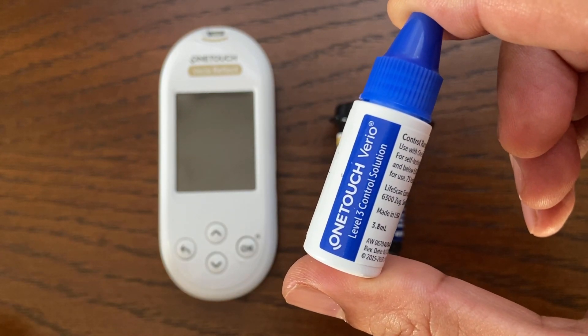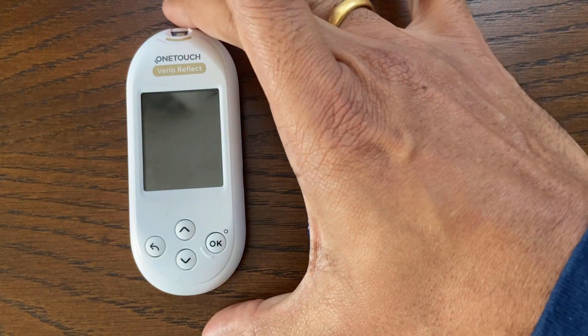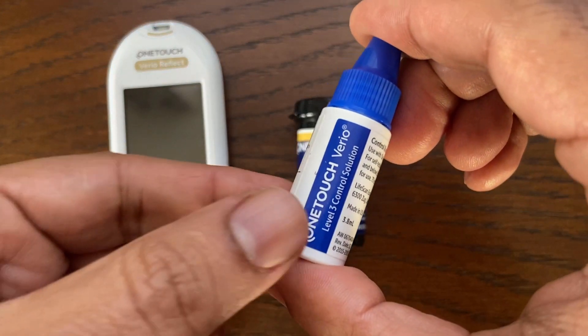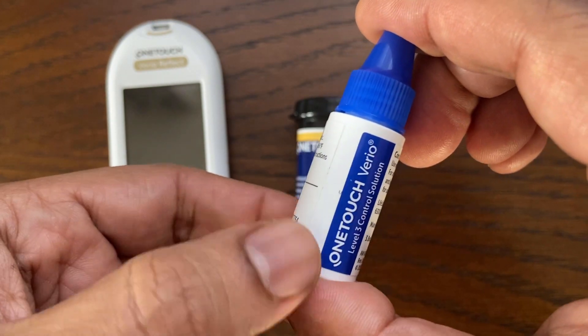This video demonstrates how to check the OneTouch Verio Reflect blood glucose meter using the control solution. To do this test you will need the meter, a test strip, and a bottle of OneTouch Verio level 3 or level 4 control solution. Either level can be used to check your system. The video description section contains a link to get the control solution.